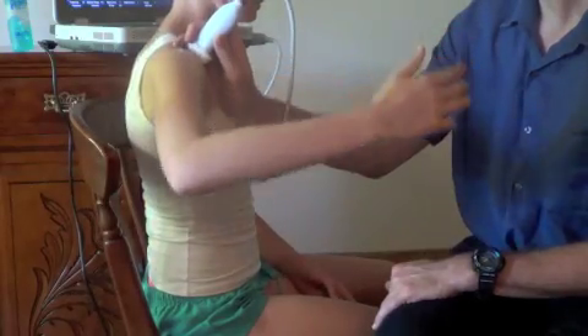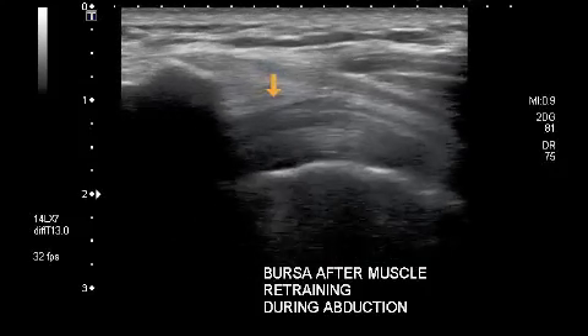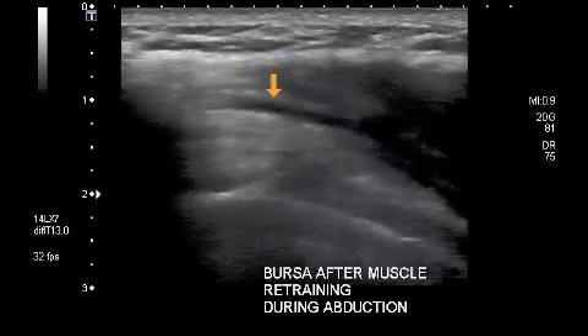After biofeedback, reassess the rotator cuff bursa complex during abduction to see if muscle activation retraining has reduced the degree of impingement and pain.